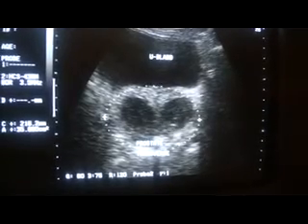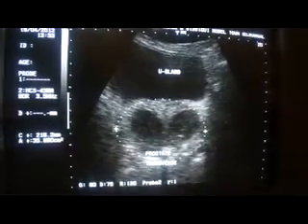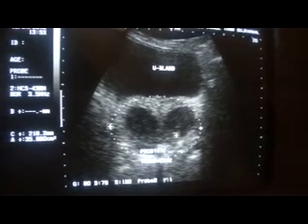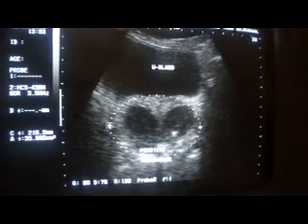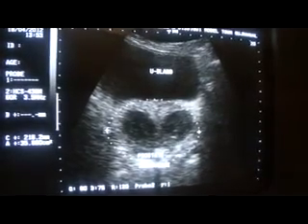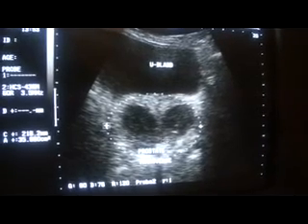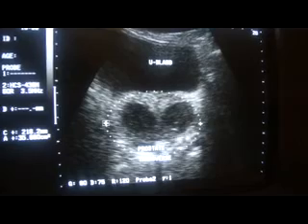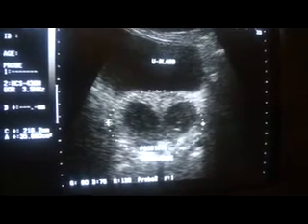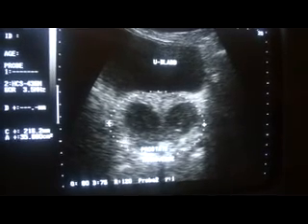So this is again a magnified view, where you are again seeing the same focal lesion filled with thick echogenic internal echoes. None of them is giving posterior wall enhancement. In longitudinal section, this echogenic area is also not giving any posterior shadowing of significance. This is in transverse section. Now we will study the rest after post-micturition.